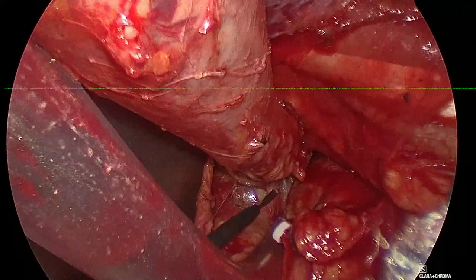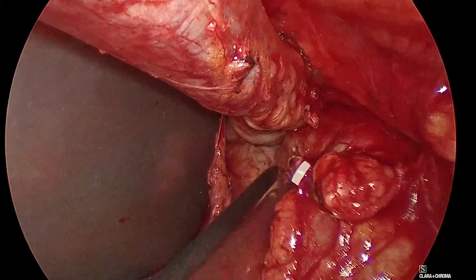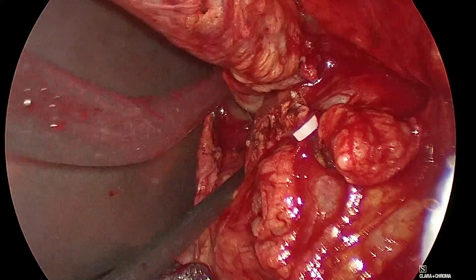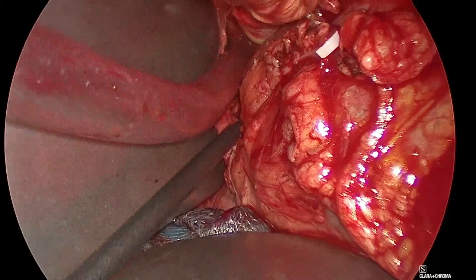I was asking if you already filled the bladder. If I already what? Filled the bladder. No, I didn't. I feel it at the very end because I want to see at the very end. Right now I'm in the Valdeyer tract and there's tumor. So I want to make sure 100% that I in fact resect all I need.